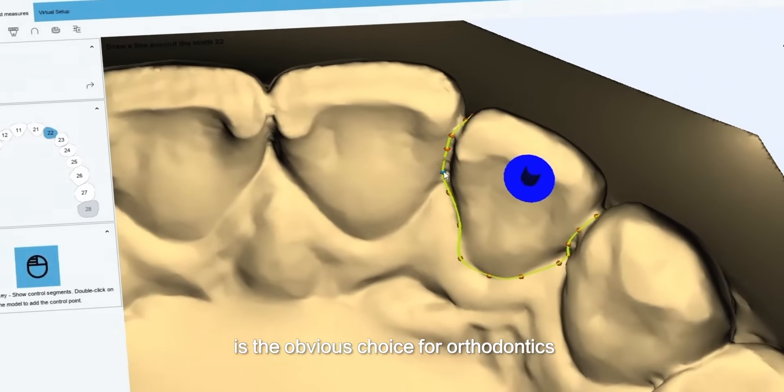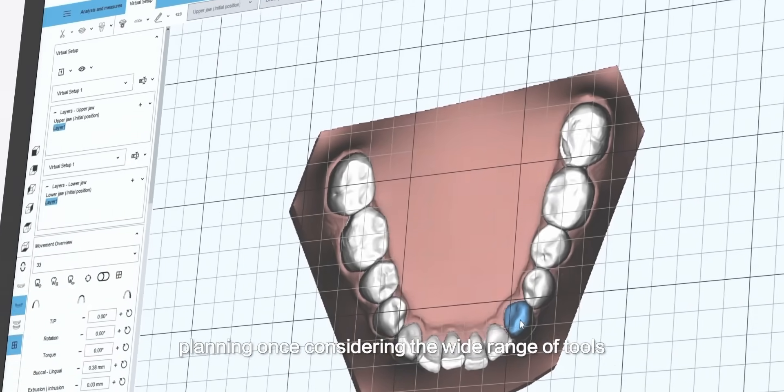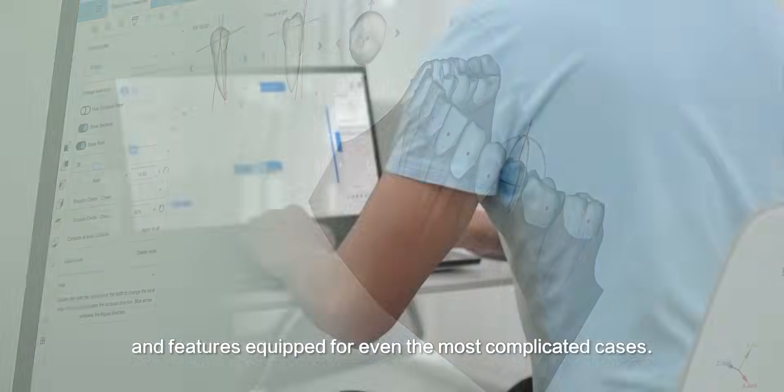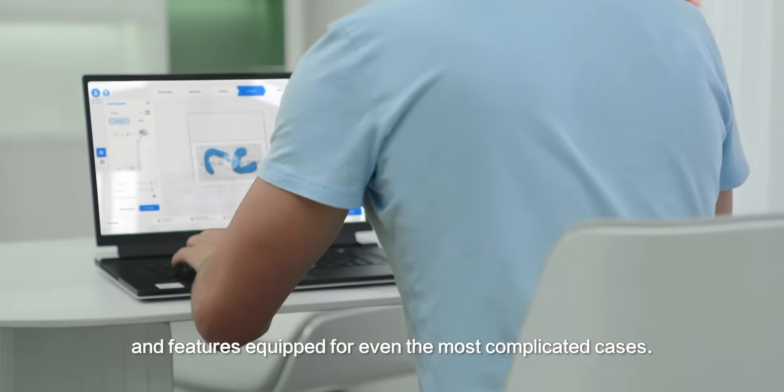Maestro 3D is the obvious choice for orthodontics planning, considering the wide range of tools and features equipped for even the most complicated cases.